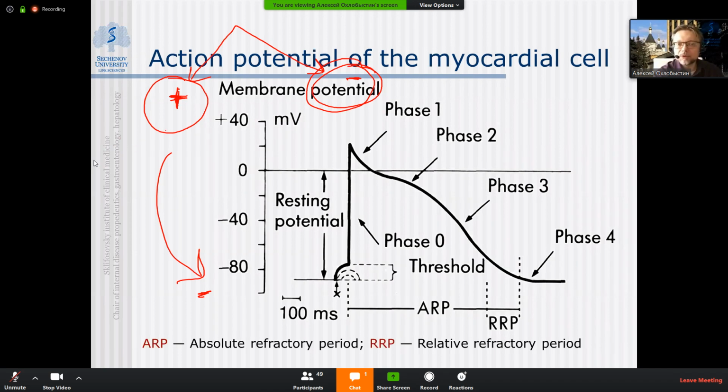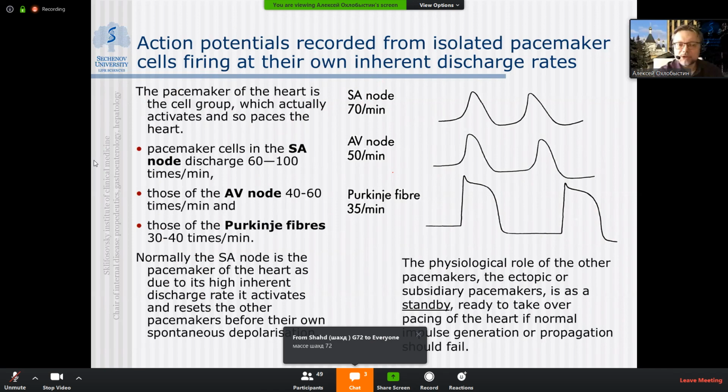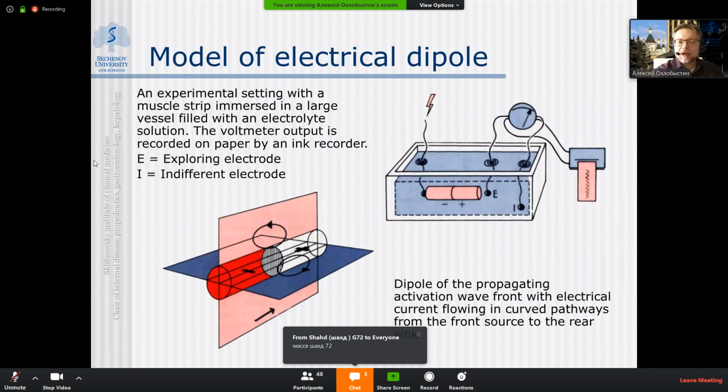But one small, tiny thing: for that, we need to apply our electrodes on the surface of the heart, to record that potential difference from location to location. Again, we cannot do this, at least when we talk about ECG itself. We can do this during surgery, and sometimes it's done. It can be done during stimulation, for instance, when we apply electrical pacemakers that are sensitive to the charge of the heart. But that will not be ECG.